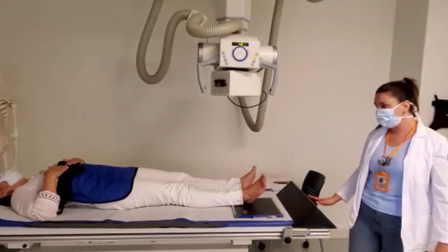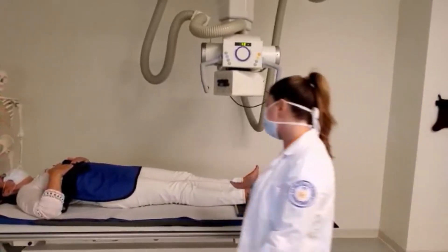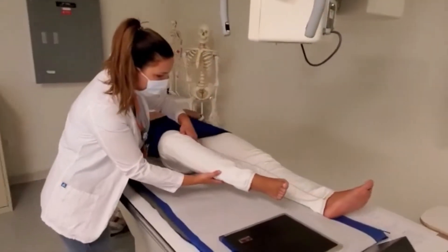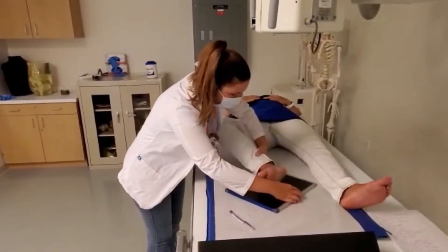For lateral foot, we have the patient point their foot and we're going to work with the patient on the side by flexing the leg, placing the foot to the middle of the IR.